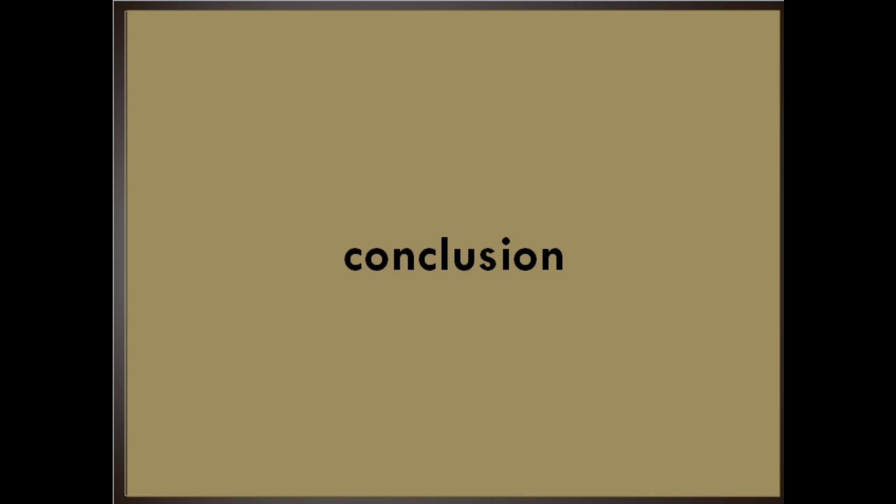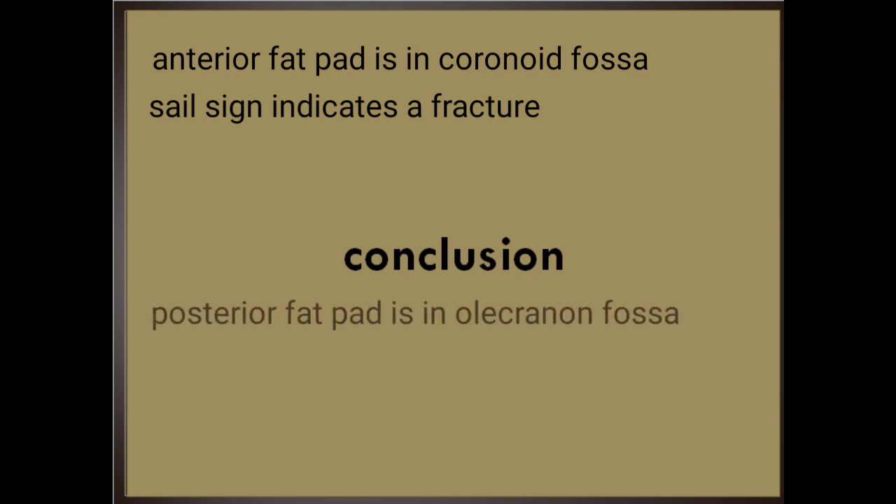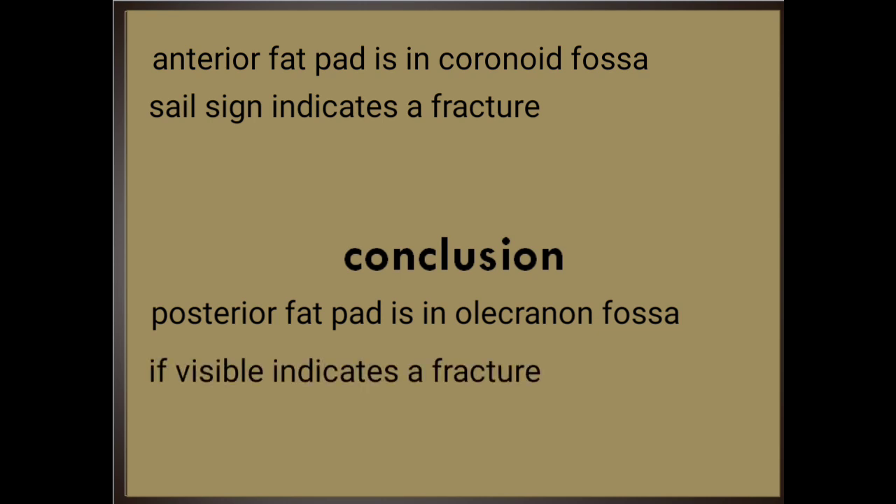Conclusion: The anterior fat pad is located in the coronoid fossa. A narrow anterior fat pad is a normal finding on the lateral view. The anterior fat pad can be displaced up and out by fluid in the elbow joint, creating the sail sign. This usually indicates a fracture in children in cases of injury. The posterior fat pad is located in the olecranon fossa on the lateral view. It shouldn't be visible under normal circumstances. Fluid in the elbow joint can displace the fat pad up and out, making it visible on the lateral view. If the posterior fat pad is visible, it suggests a fracture in the setting of an injury.